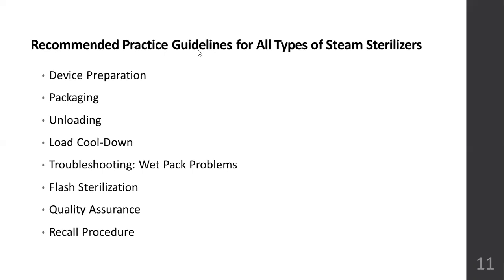You have to also make sure that your sterilizer is meeting all the standards. Physical structure of the sterilizer should be solid, high quality, stainless steel, or whatever is the material of the sterilizer. They should be of good quality. Proper electricity supply is there. There is no chance of short circuit and all. These things will come under device preparation.